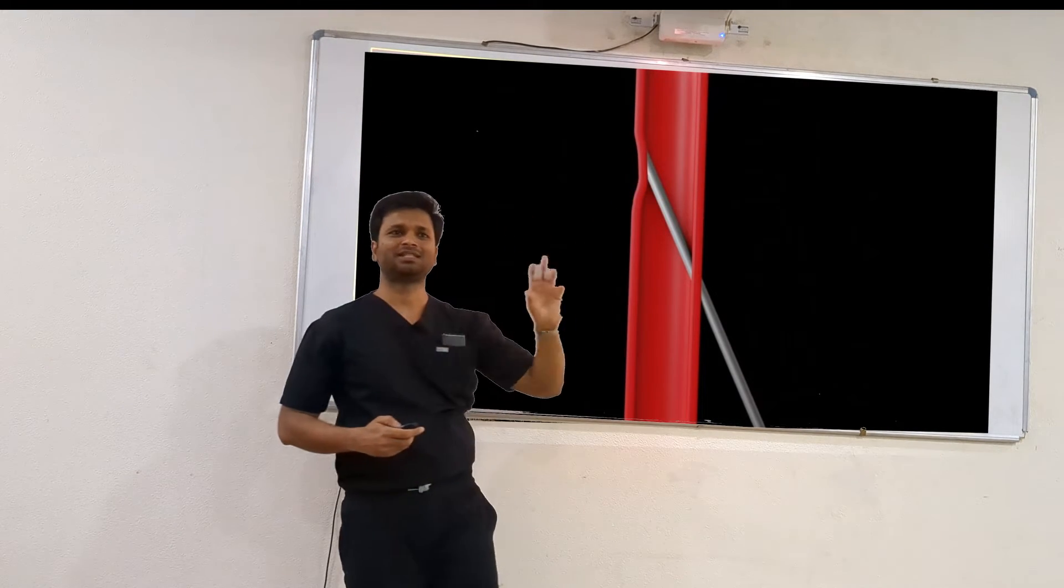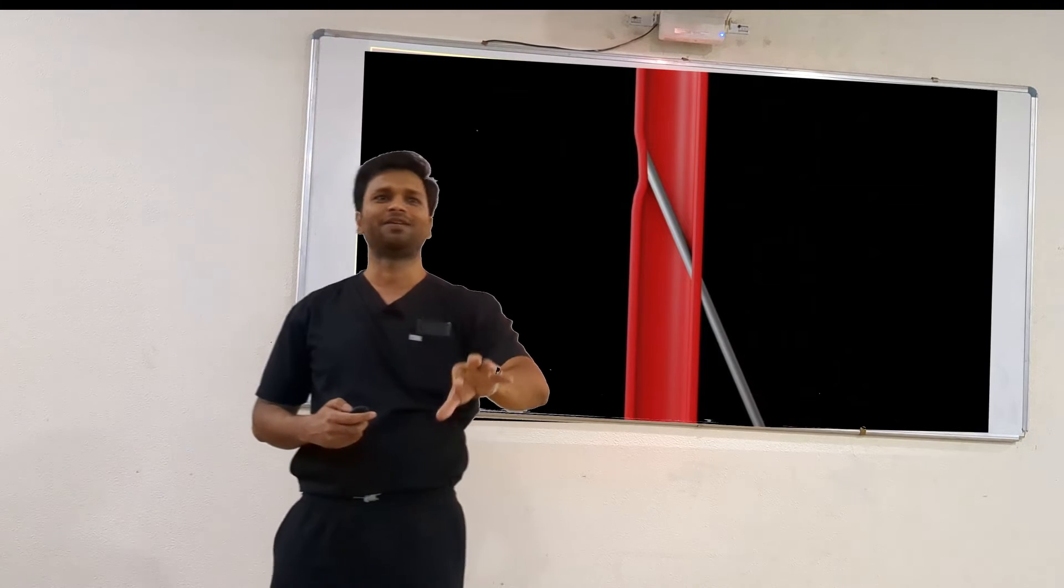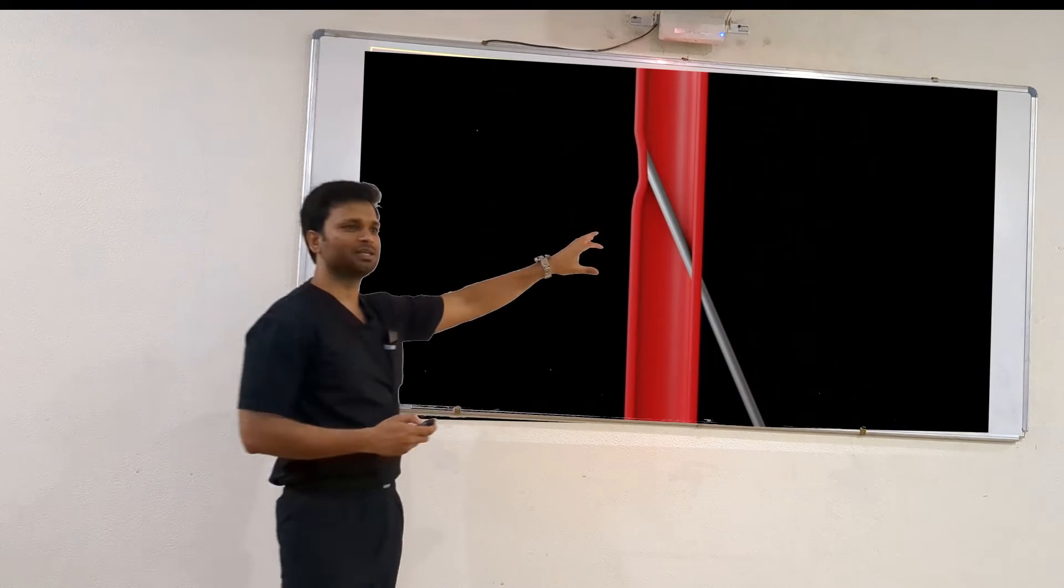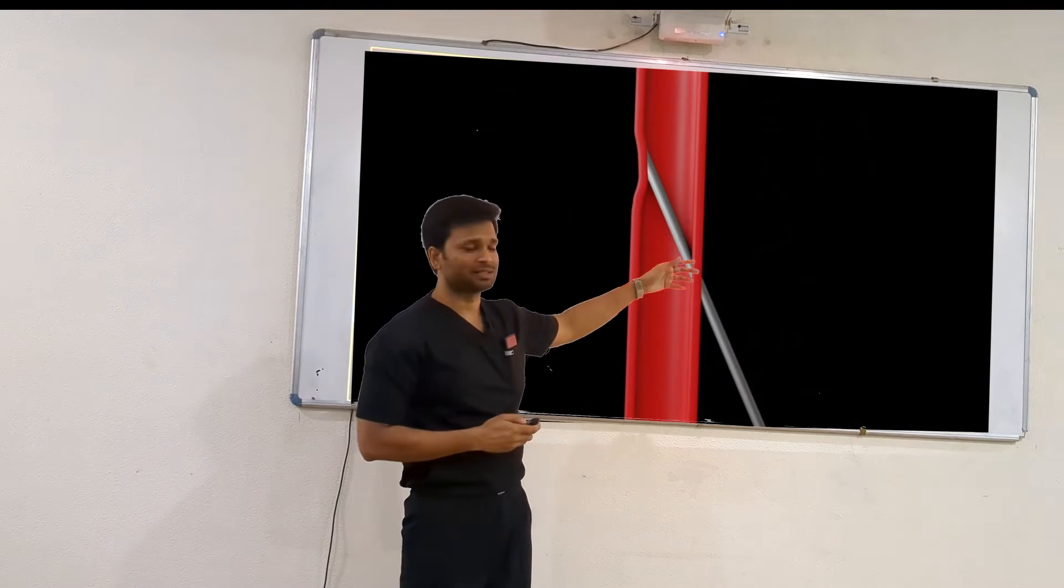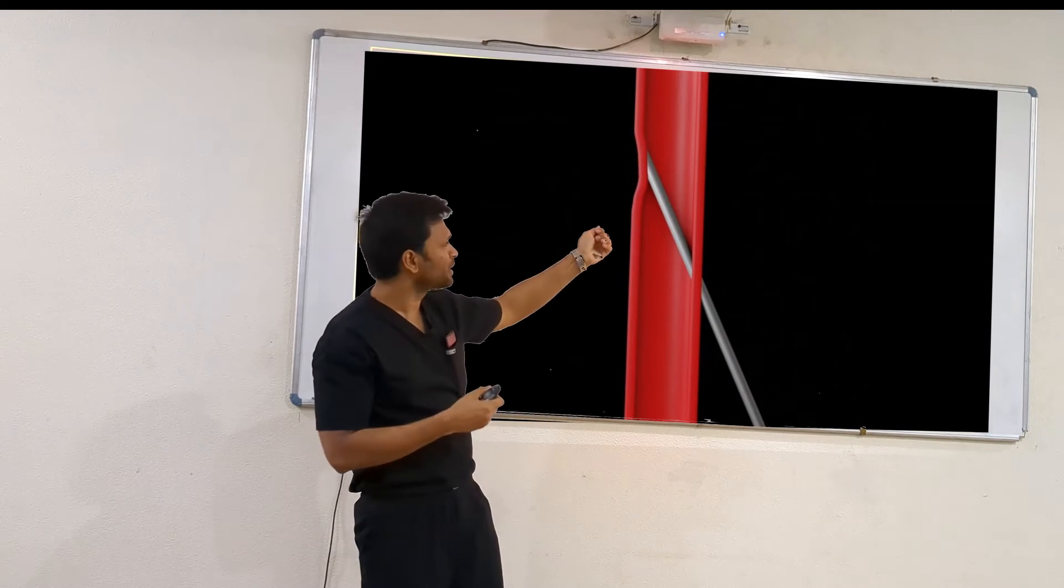So now, even though the needle is inside the blood vessel, we are getting a negative aspiration. This is something called a false negative. So how do you manage this? Now you have a negative pressure created.